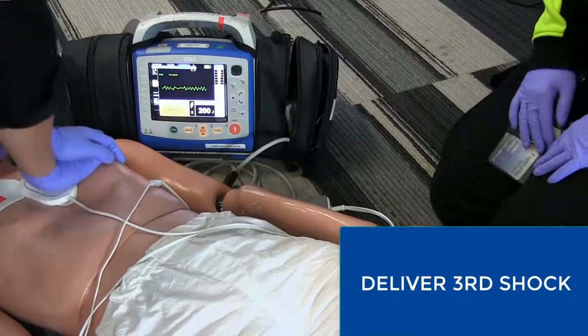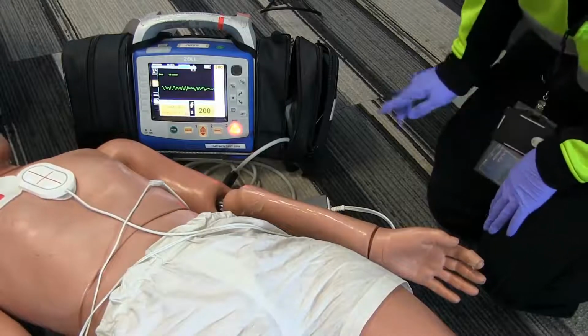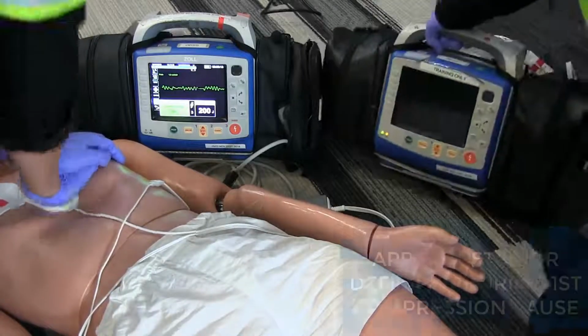After your third shock has been delivered, prepare the second X series for double sequential. Okay, stop CPR. I'm clear, you're clear, everybody's clear. Third shock delivered. The patient's now in the dose VF double sequential arm of the study.